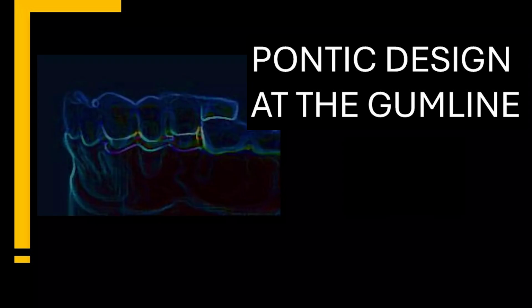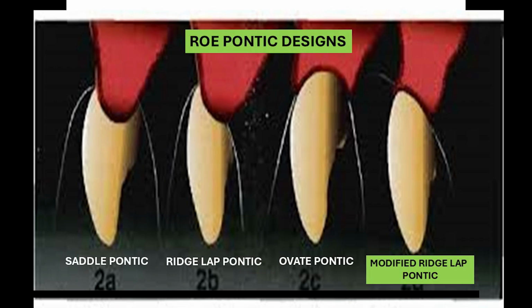But this is a rerun, and it's a good rerun. It's about Pontics, and I've changed it a little bit. I went over it before I presented it. I'm going to present it today, and made some good changes. So these are our 4 different Pontic designs.